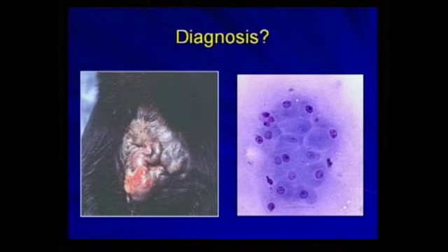And then from this area, obviously the most likely, if you just looked at the numbers, in a male dog, especially one who is not castrated, is going to be the perianal gland adenoma, also known as the hepatoid adenoma, because of its resemblance microscopically to liver cells. And if we look at this clump of cells, we can see that sort of hepatoid appearance. And then around the outside of this clump of cells, we see some smaller nuclei of cells with less cytoplasm.